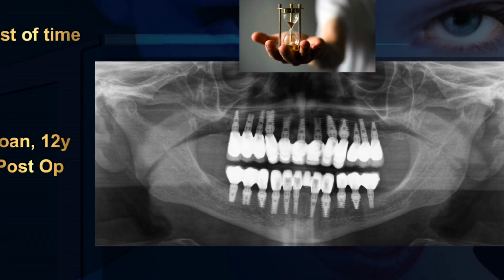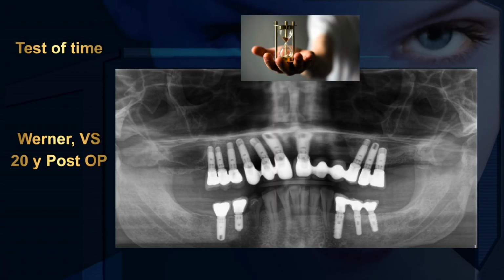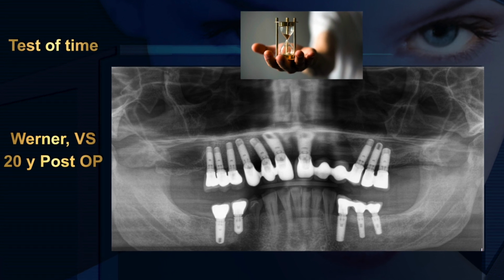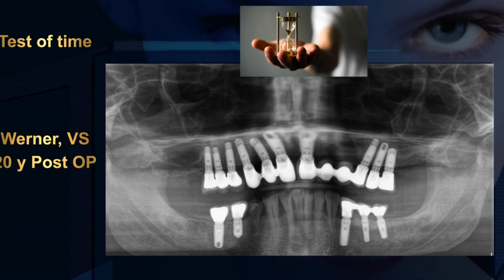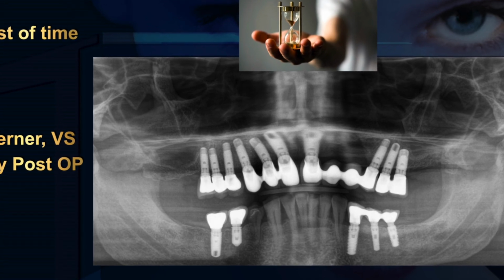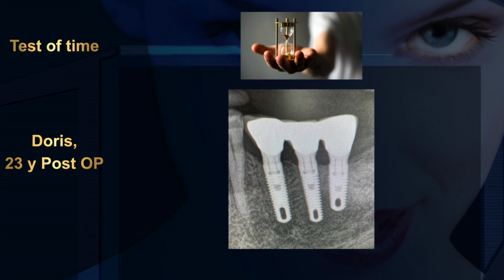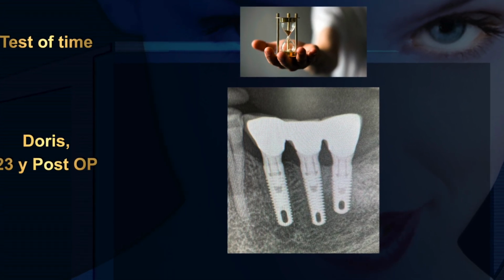Nevertheless, 12 years post-op, situation is stable. This is another Werner, this time from our area. 19, almost 20 years post-op, stable situation again. This is Doris, 23 years post-op.